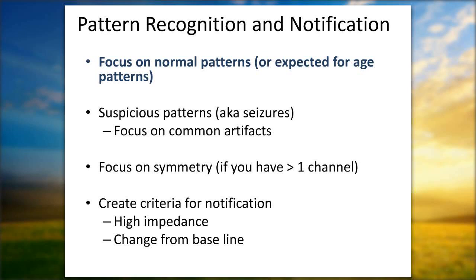Something I didn't mention that maybe we can discuss in the forum a little bit more is who's using EEG only and who's using aEEG during cooling. I think that's always an important discussion, and I don't know if you want to type in what you're doing.